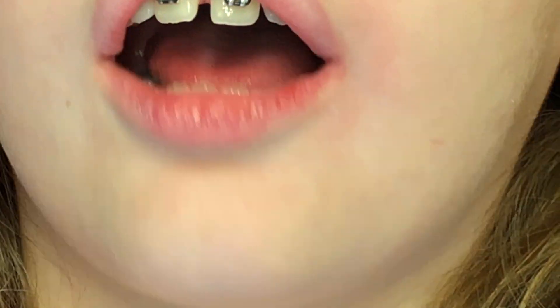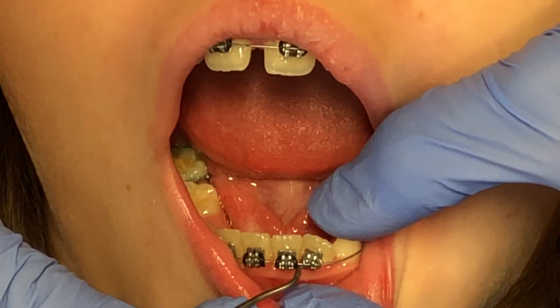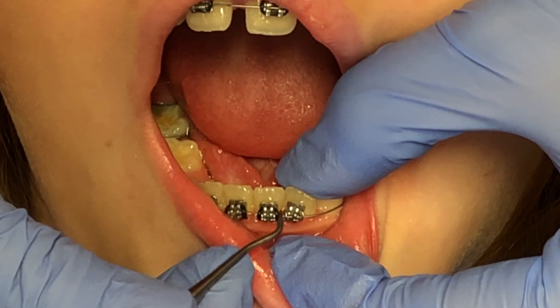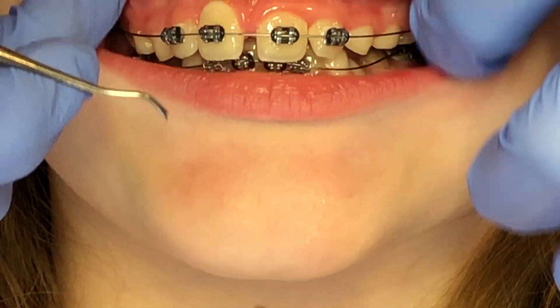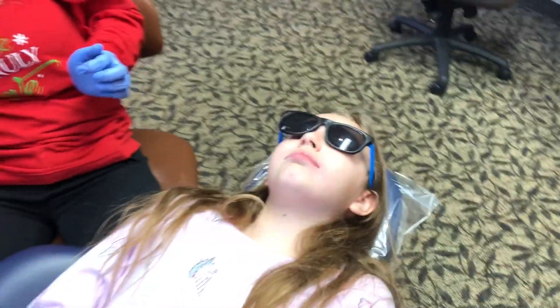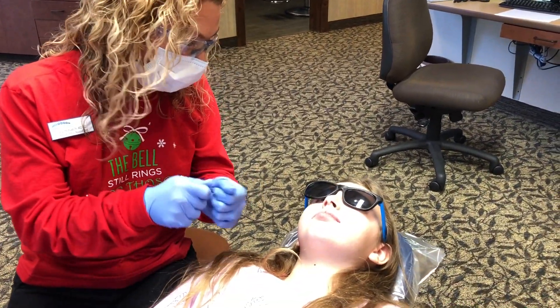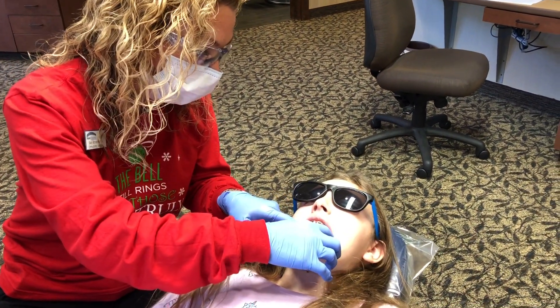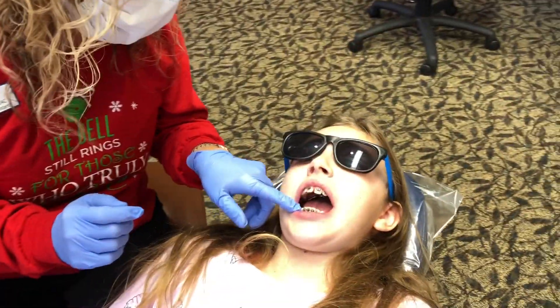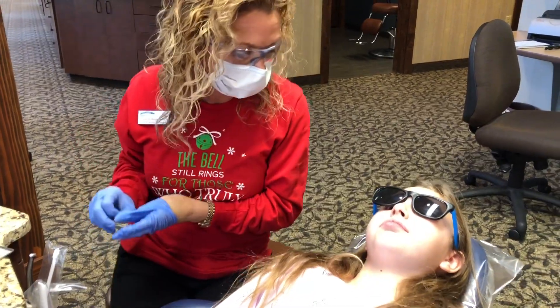That was good — y'all came in, you probably wouldn't have been able to do that at home. All right, thank you. She's good. Keep that appointment for two weeks and just be careful with anything super hard — either break it up, cut it, or have mom cut it and then put it in and chew it. Because if it gets pressed on again it can pop back out, but hopefully it'll hang in there for two weeks, and we'll put a thicker wire in.